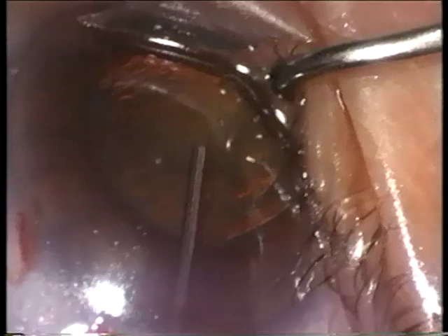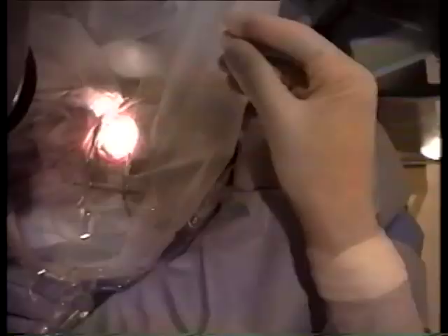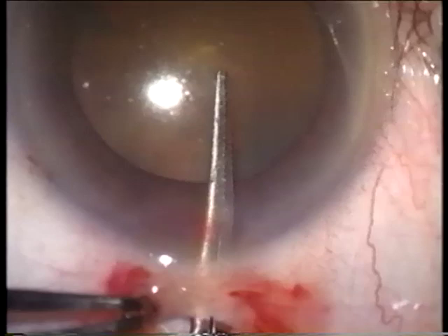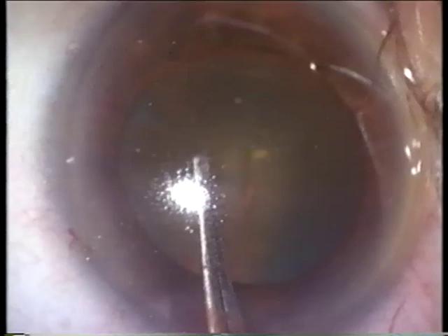I go obliquely as well. Superior-nasally is a little difficult, but unless there's a very high nasal bridge or brow, you can usually operate superior-nasally. Now it's a little awkward here — I'm just going to turn your head this way a little bit and have to ask you to look down just a little. That's pretty good there. You can see we can usually have the patient move the eye to where it's optimal. Can you look down just a little? The red reflex was in the way there, I was losing my edge of the capsule.